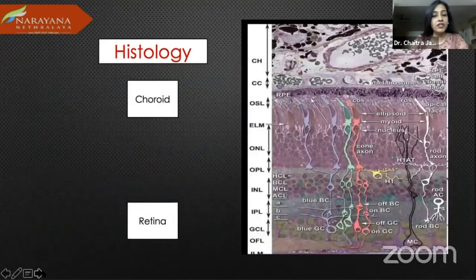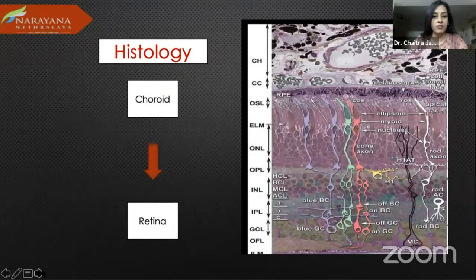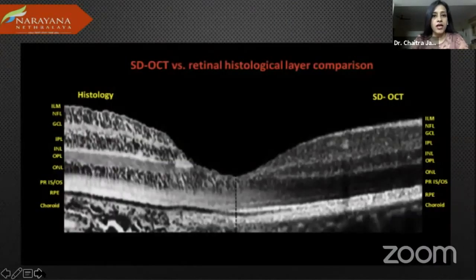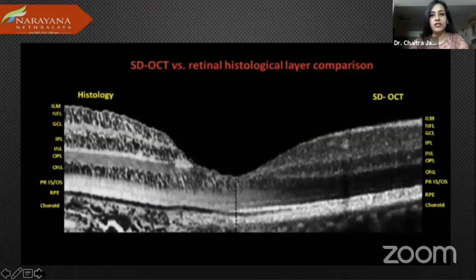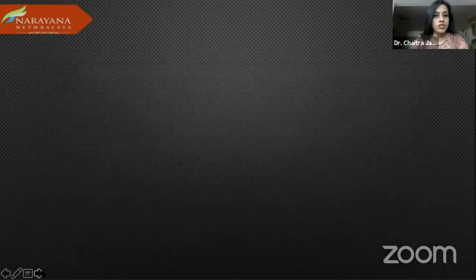OCT also gives us a lot of histological details right from the retina up to the choroid. As you can see here, there is a good comparison between the spectral domain OCT and the retinal histological layer comparison, and you can actually see each and every layer very well delineated. So this is, again, the big advantage of OCT.